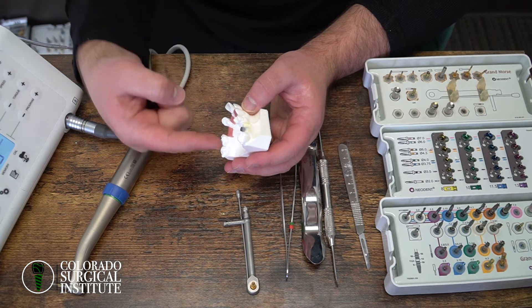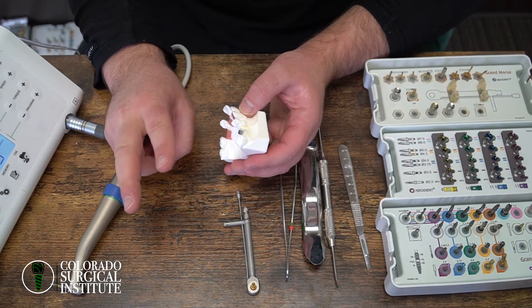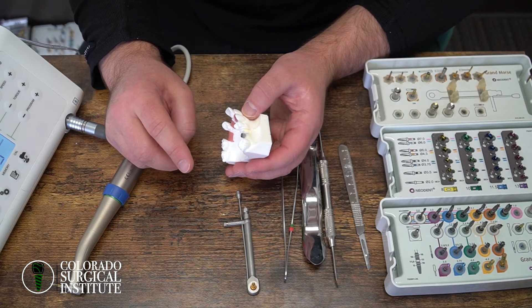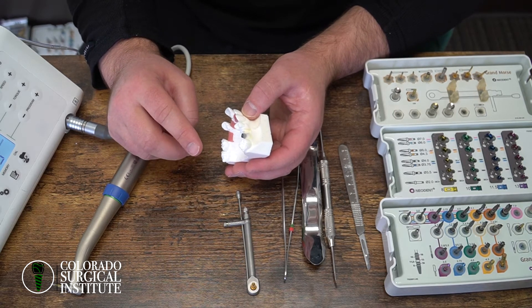Once you put the implant back in, it should go down a little bit further. If it isn't, there are two things to check: make sure you're actually drilling to the correct depth, and also check the width.